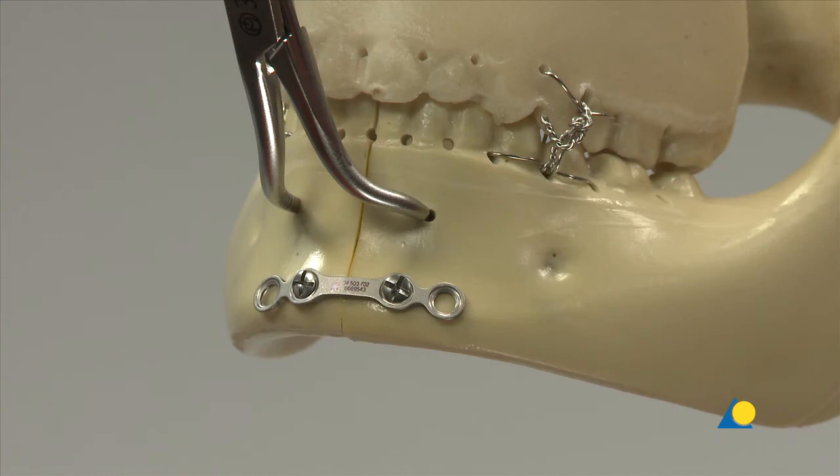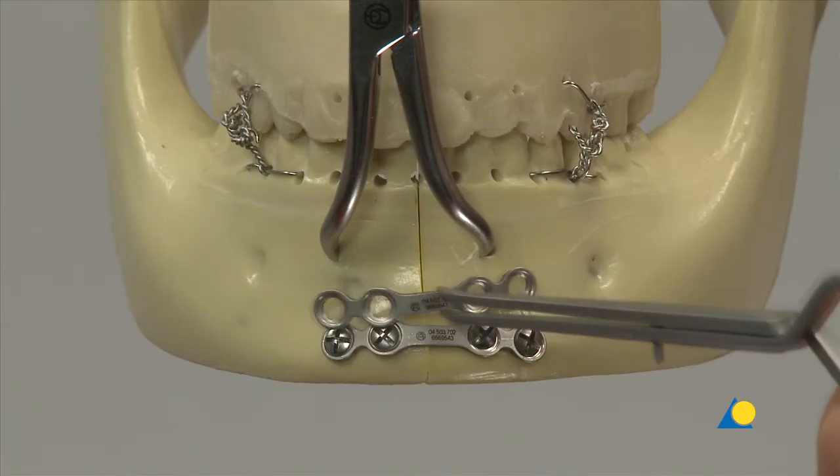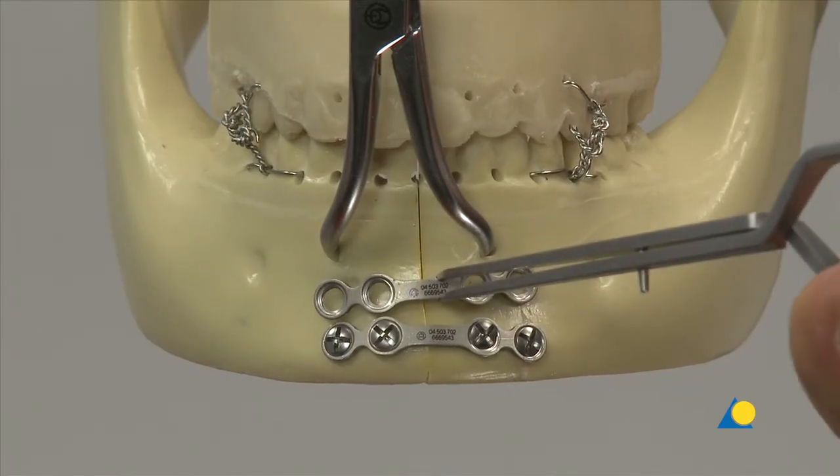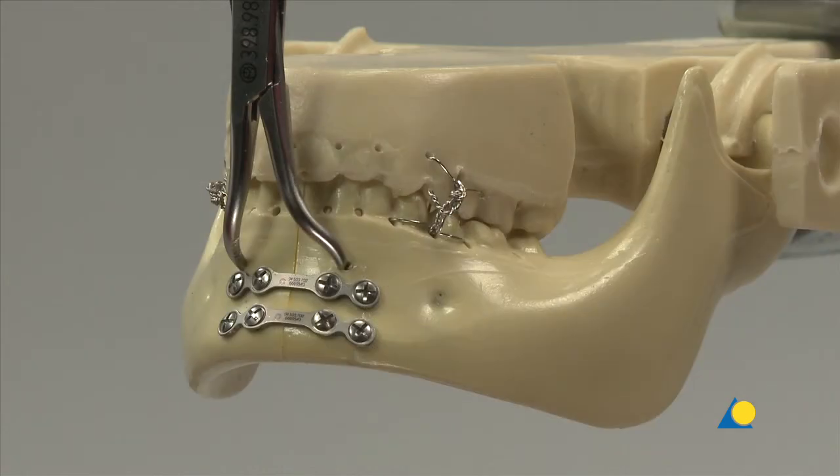Both screws are tightened. The remaining screws are placed. Now, a second 1 mm thick matrix mandible mini plate is applied. This plate is placed below the tooth roots in order to avoid damaging them.